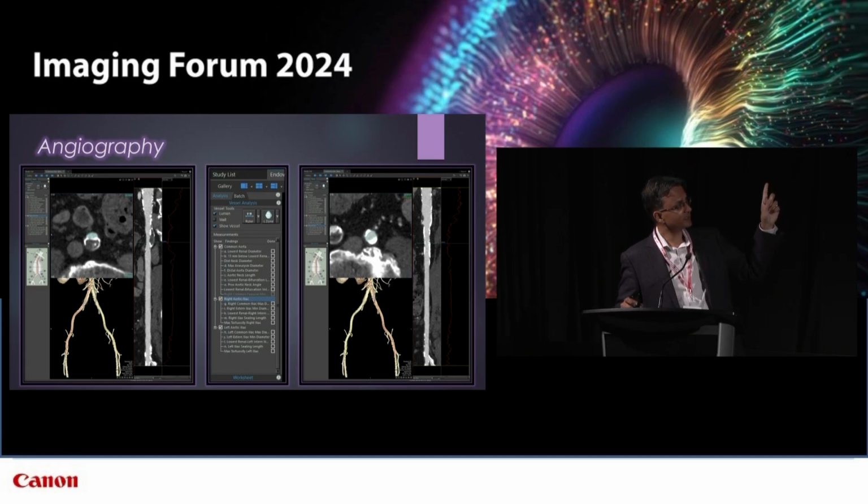So in this example, the image on the left, which is the patient's right iliofemoral system, you can see just how dramatic the decrease in luminal caliber is. So we used to actually have thresholds when the TAVI program first started, and they said, well, we want to know this number, that number. Now, because of the plethora of devices that they use, we actually just provide the numbers and let them make their own decision on it.